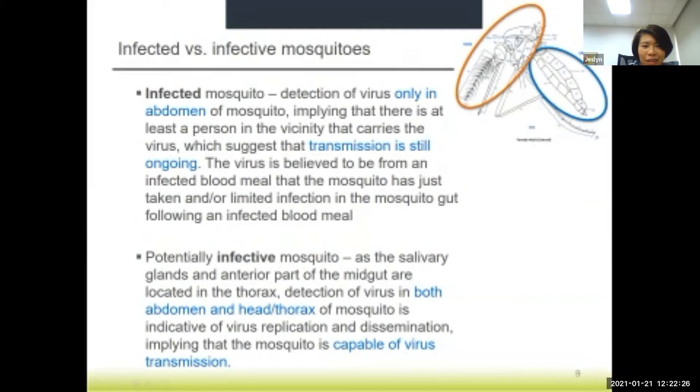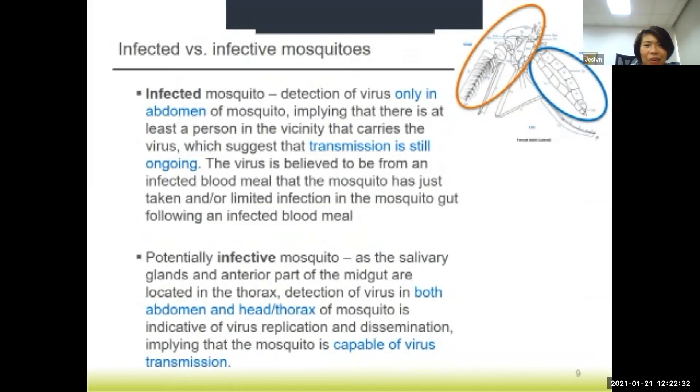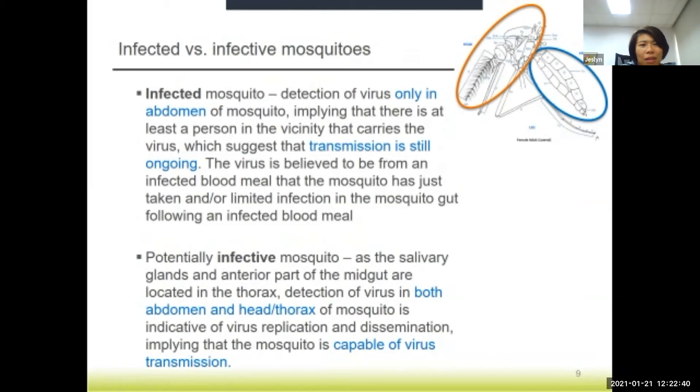Hopefully that answers the earlier question about how to spread the samples for loading. So what do we do with the results of the test? From the field-collected mosquitoes, there are a few ways of processing the samples, and these can lead to different ways of interpreting the results.